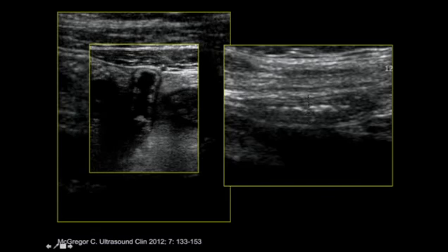And in addition, when you really look at the submucosal layer carefully and analyze it, you'll see multifocal irregularities of the submucosal layer that is very concerning for appendicitis. Now, the other thing for this patient, measuring a little bit more than 6 millimeters, non-compressive and rounded in cross-section, is that we in fact found another cause for her right lower quadrant pain, which makes us even more confident that this is a false positive on ultrasound.